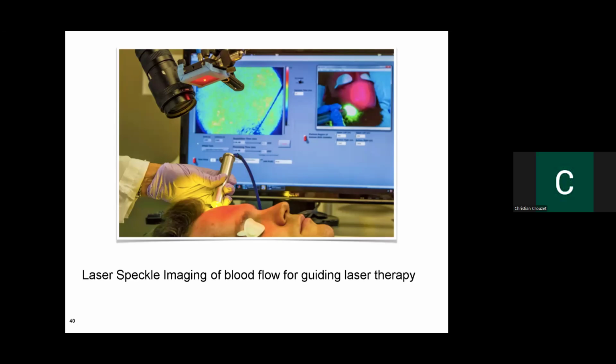So I'm not an expert on this, but I'll try my best. So the question is how many passes would it take to know that they're done with the treatment, basically, right? Based on my understanding, when they do the treatment, the doctor could look at the amount of, I believe it's called purpura, that would occur when doing the laser therapy.